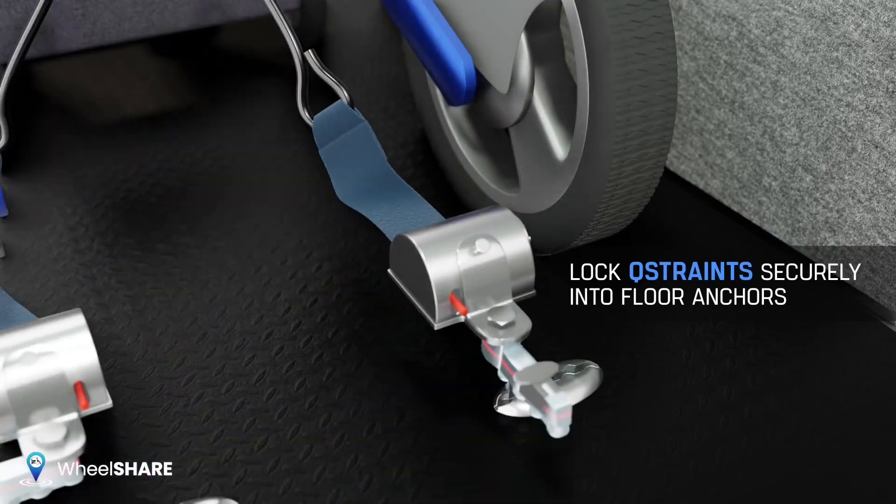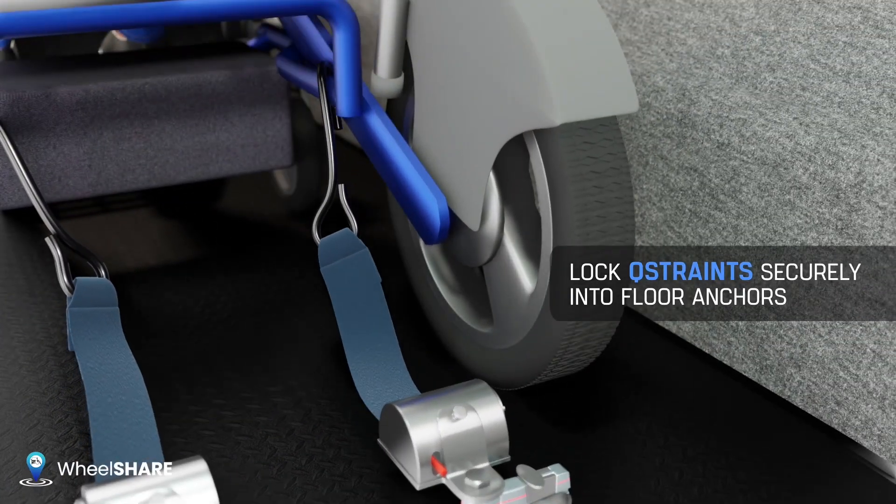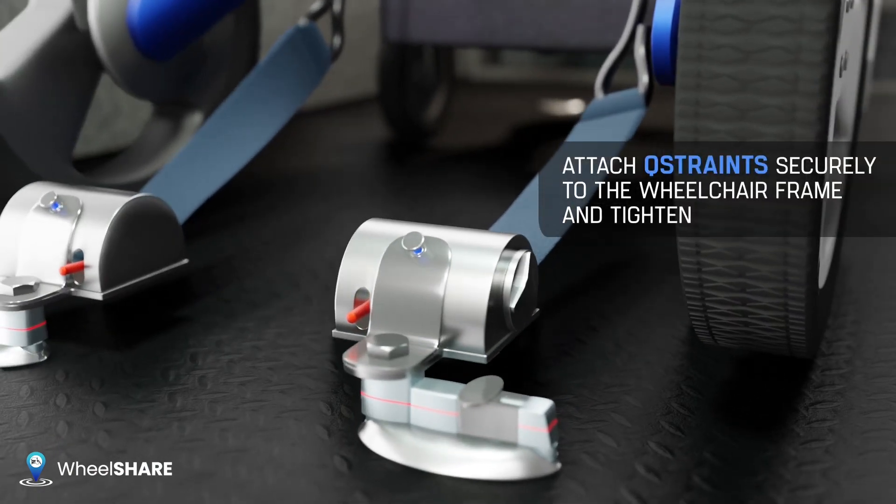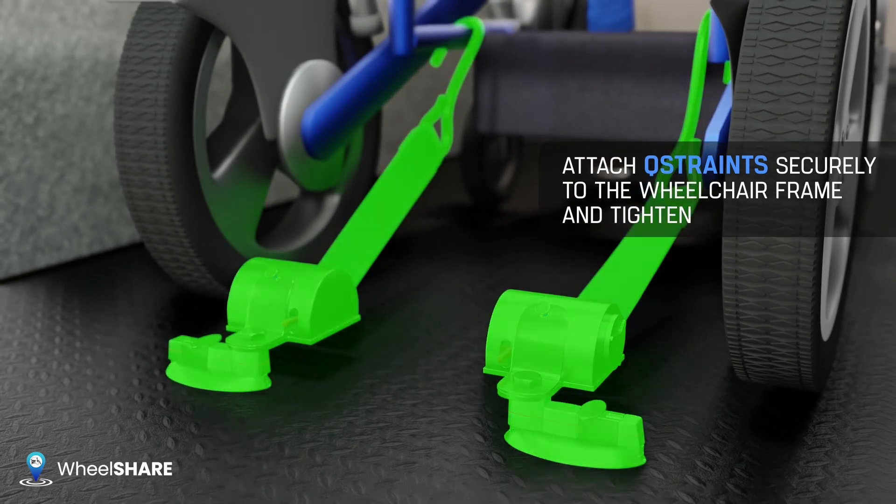To ensure your passenger is secure, lock all four Q-straps securely into the floor anchors. Attach all four Q-straps securely to the wheelchair frame and tighten.